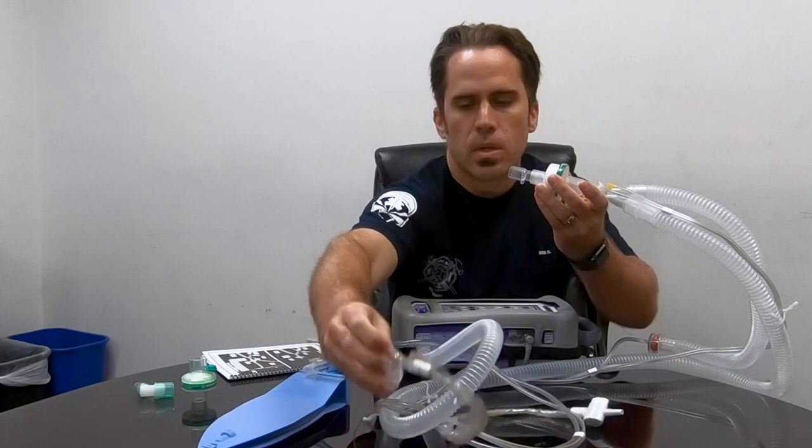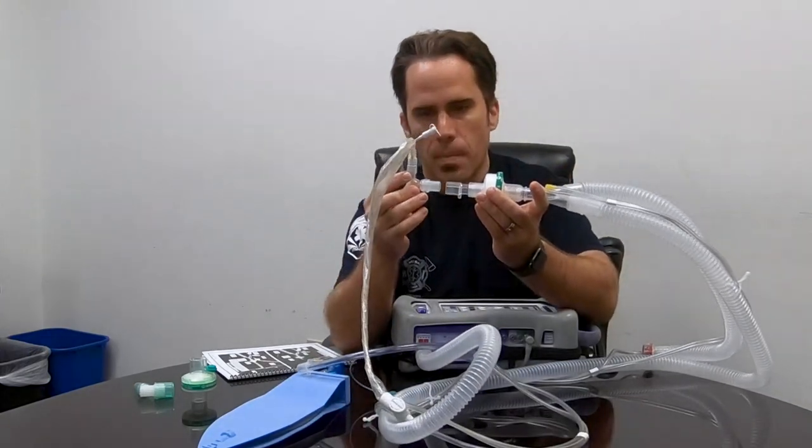Next thing we put on is our end-tidal CO2. This tells us how fast or slow the breathing is and confirms that our tube is still good, giving us lots of information. Then we put on our Ballard suction.